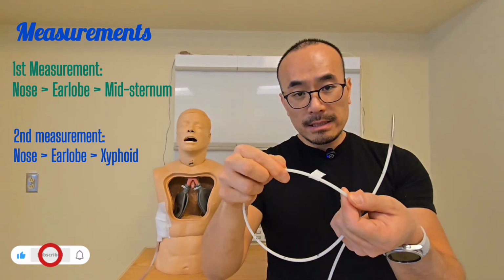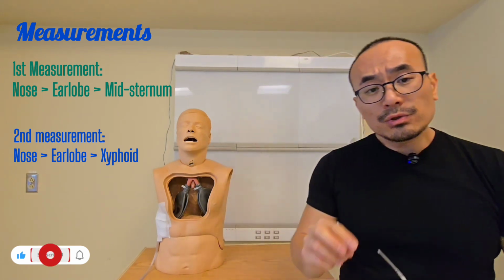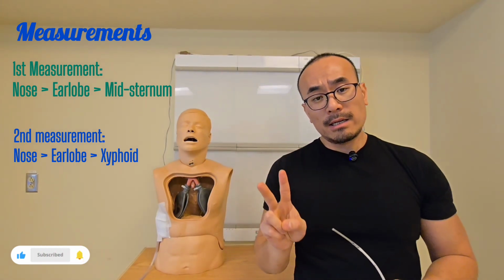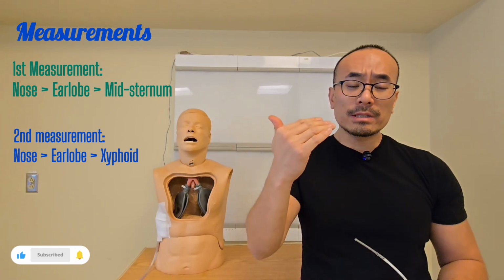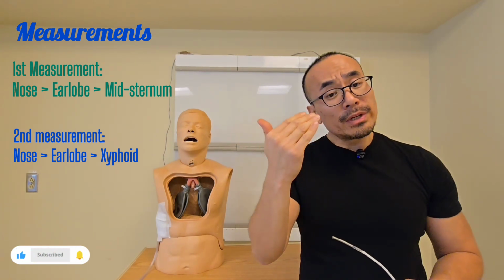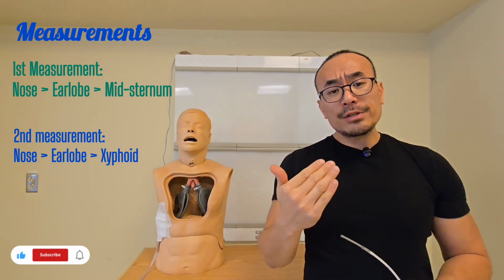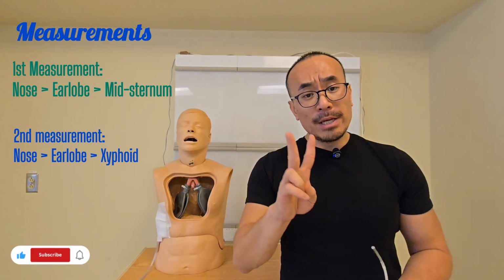And this is the piece that is gonna end up right at the nose. When we need to do a two steps NG insertion, this one's especially for those patients who are more drowsy, they are still breathing spontaneously, or patients who are in CCU or in some ICU patients. So we're gonna measure it twice.